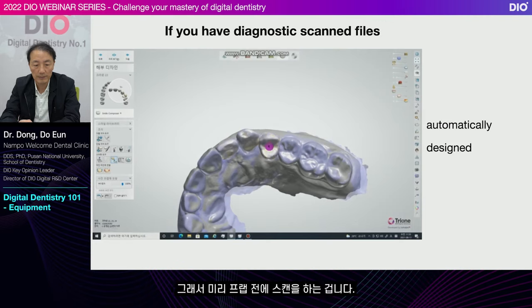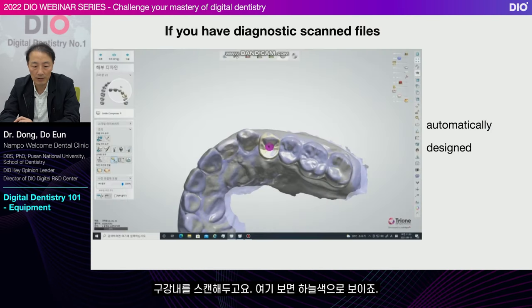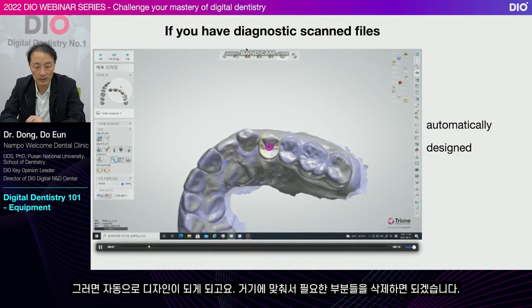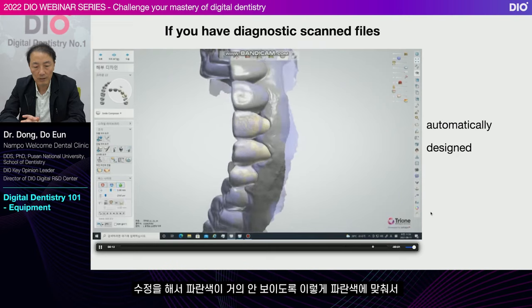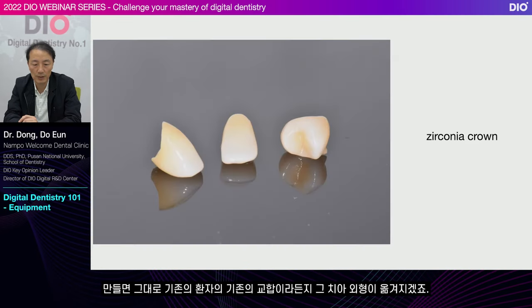So, before the prep, I do an oral scan. I take an oral scan first before doing any treatment. Scan the mouth. You see this light blue here. The blue color shows the previous data. We align it to this when we place the prosthesis on number 4. Then it designs automatically. And you delete the necessary parts accordingly. If you modify it so that the blue doesn't show and make it based on the blue color, then the patient's existing occlusion or the tooth shape will be transferred as they are, and you make the crown.